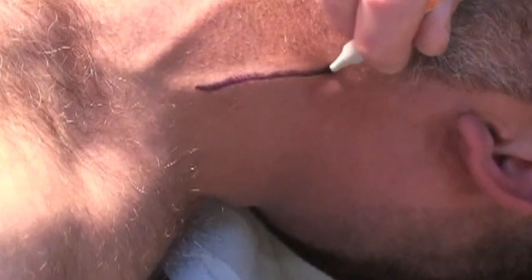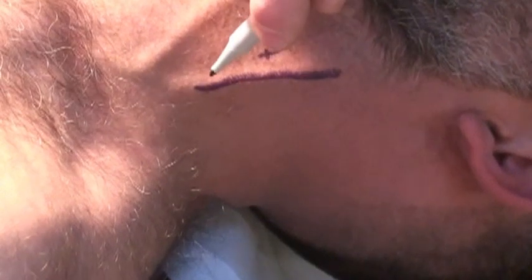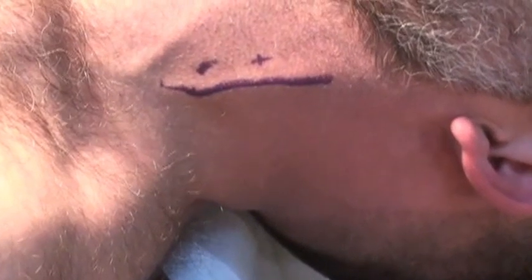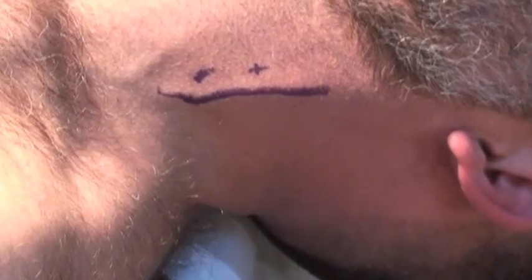Many patients won't be able to lie flat for long or Valsalva for a very long time. So once you've located the vein, mark it with a Sharpie or a tissue marking pen. You'll see I'm also putting two little dots on either side of this line. This way, you can sit the patient back up while you arrange all your materials and get ready for the procedure.